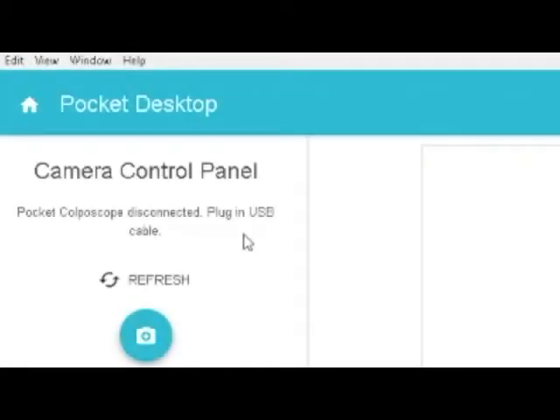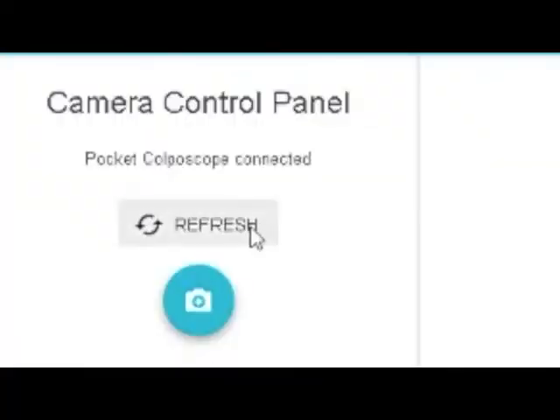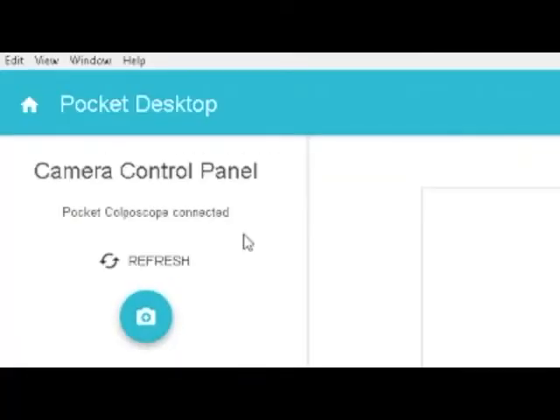When starting an exam, if the message says pocket colposcope disconnected, plug in USB cable, unplug and then replug the USB cord before pressing the refresh button. The pocket colposcope should be reconnected, but if not, please contact Hadley Health Technologies.